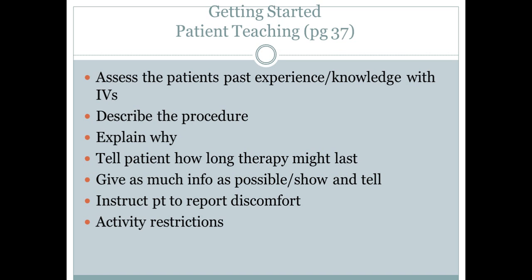If you have the chance when you start an IV, and let's say both hand veins look good, you might want to ask the patient, are you right or left-handed? And try to pick the hand, if you have that choice, of their non-dominant hand, so that if they do need to write or dial a phone or do whatever, you can let them keep that dominant hand so that it won't affect any activity restrictions.